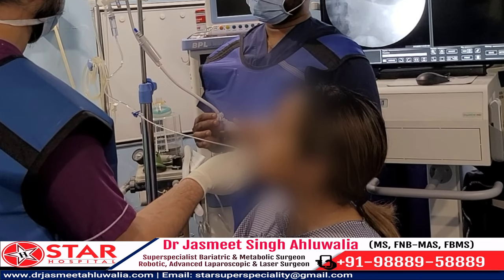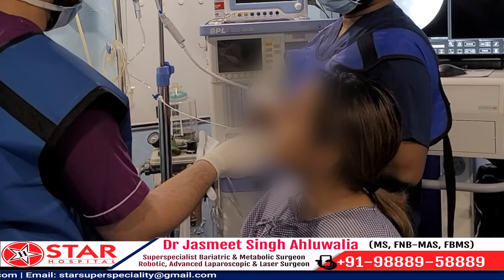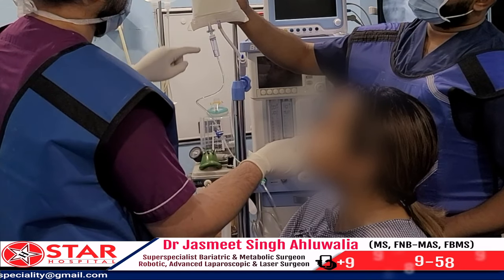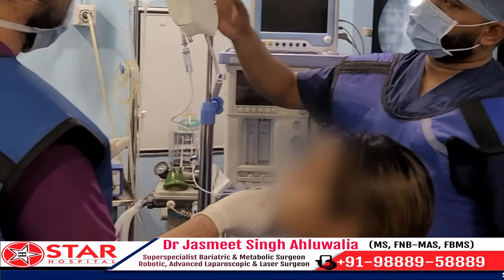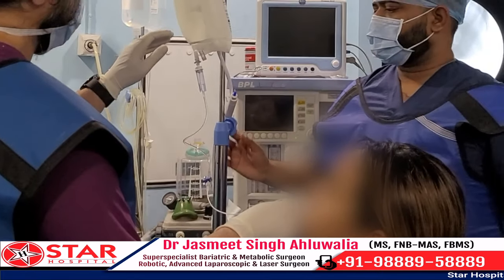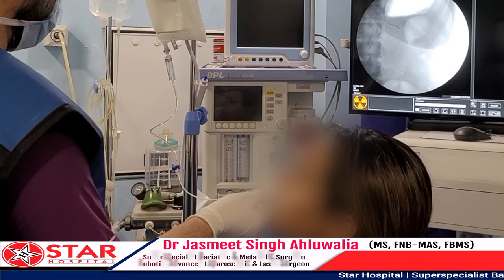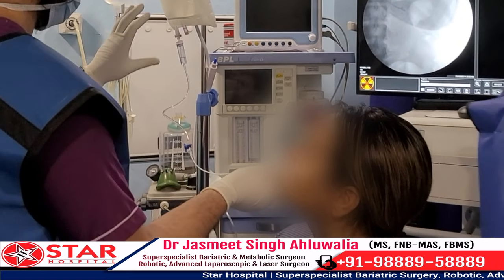Usually this is completed within two to ten minutes. The capsule has now dissolved and the fluid has started to fill. As the fluid fills, the patient hardly feels any discomfort. The whole process is going to be complete within just two minutes and the patient stays very comfortable throughout the entire procedure.